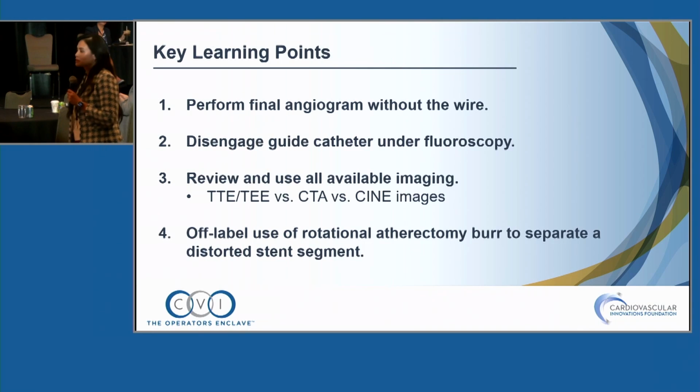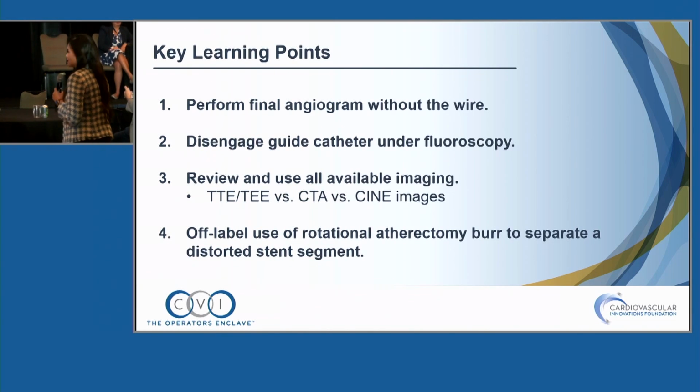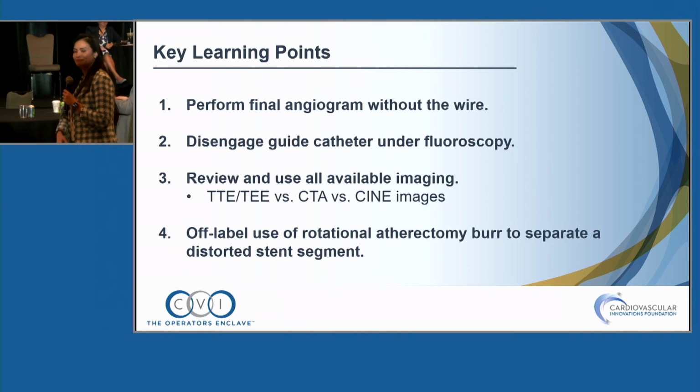And lastly, our case demonstrated the off-label use of a rotational atherectomy burr to cut and separate a distorted stent segment at the ostial RCA for safe explantation from the body.